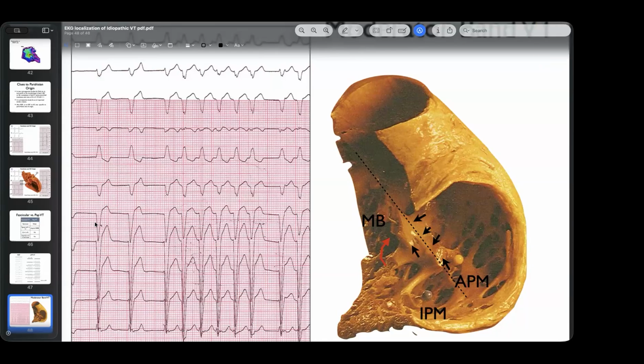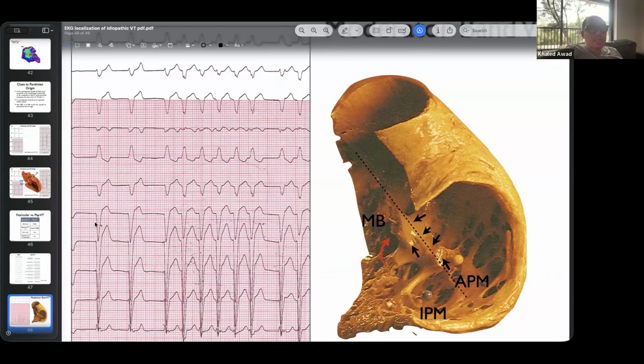Also in the middle cardiac vein, with this difficult angle. Middle cardiac is really difficult to get to, and that might be a situation where the sheath could be helpful. But because you don't have a lot of bearing in the coronary sinus, you have nothing to stand on. You barely get into the ostium, and then you have to turn and go anterior. And so I've done it before also without a sheath.